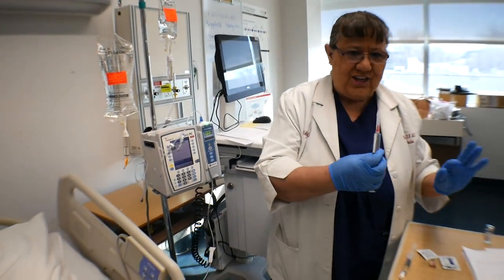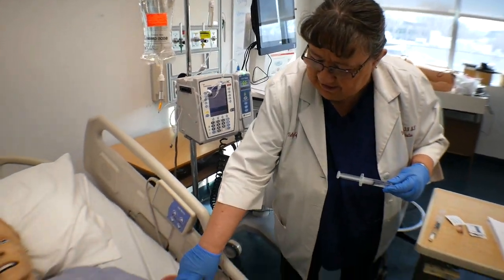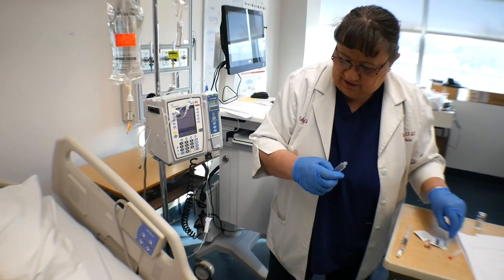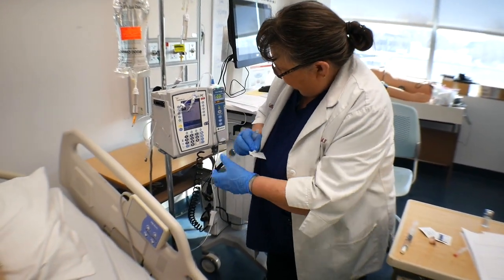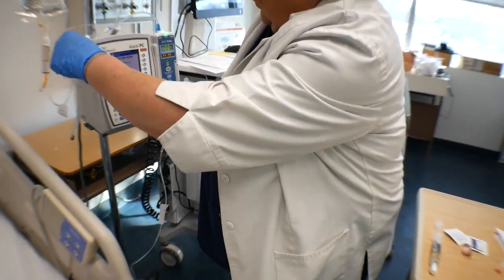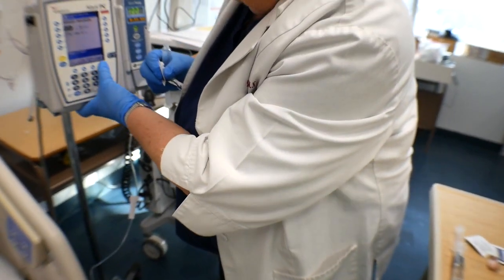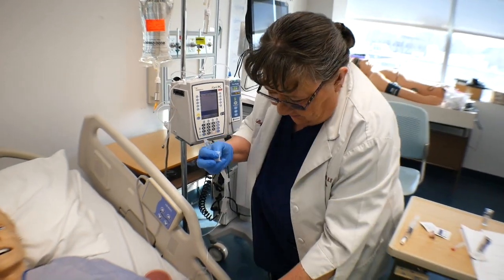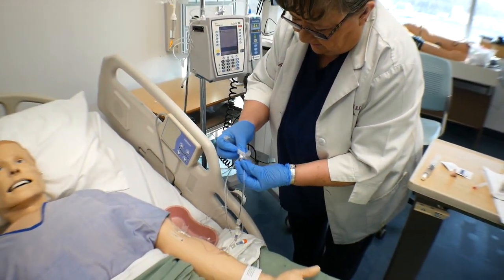I have my medication. I've already scanned it. I check the IV site to make sure it's patent. And then I need to find the lowest port. Did I hit restart? Start. Right there. Okay. So I'm going to find the lowest port from the patient, and it's this one. I need to clean it.